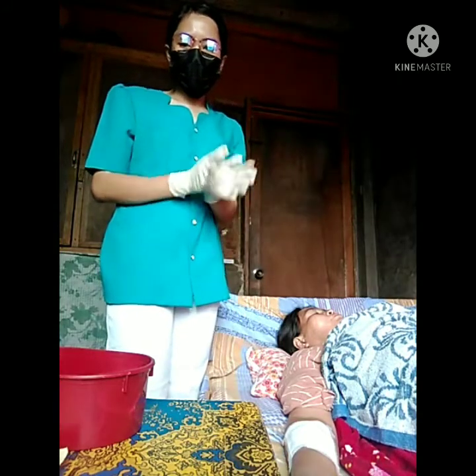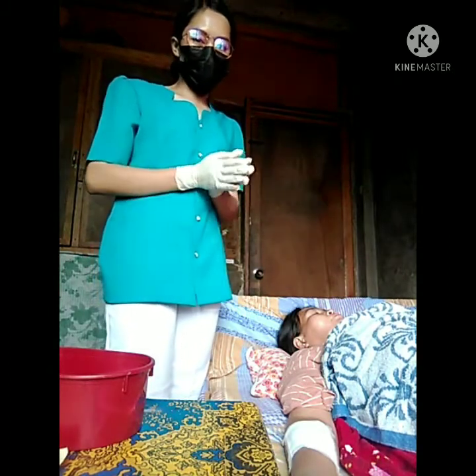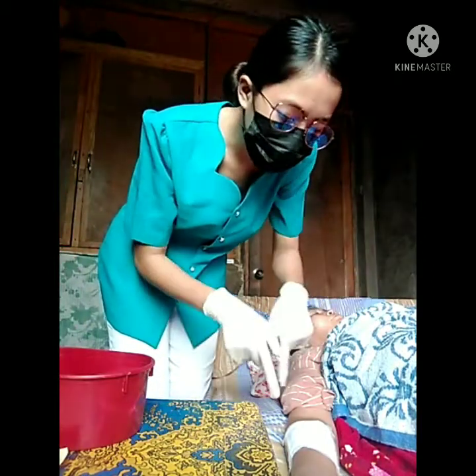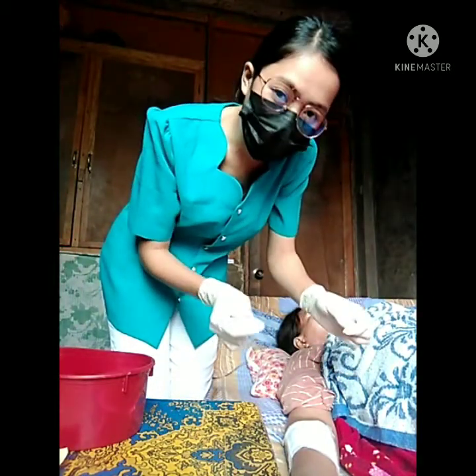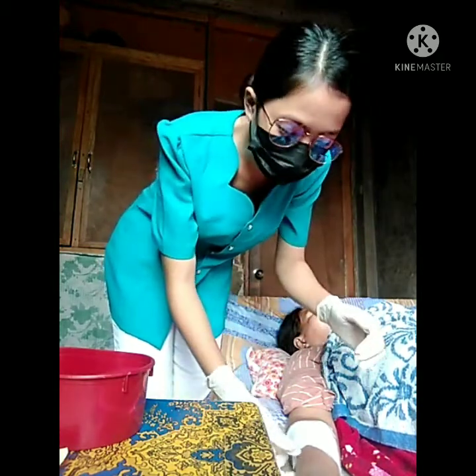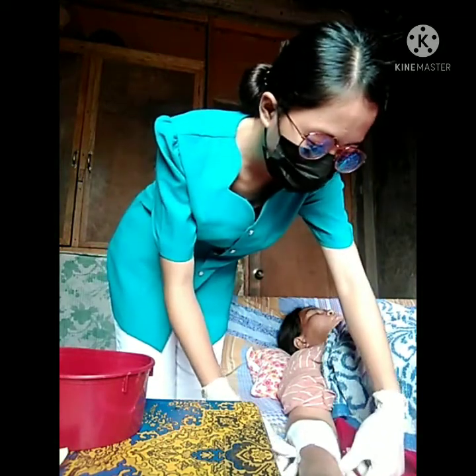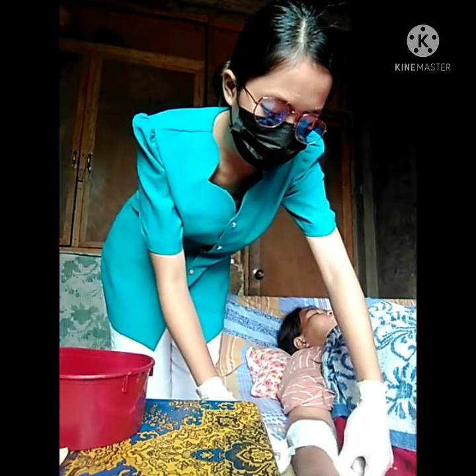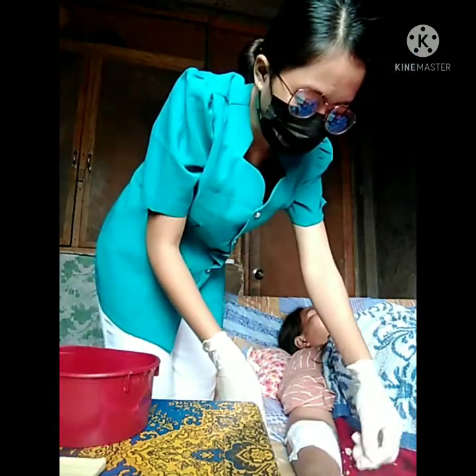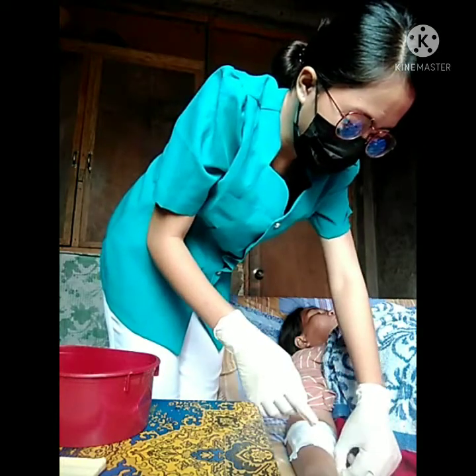And then the next step is to remove the tape, bandage, or ties, with comfort for the patient.